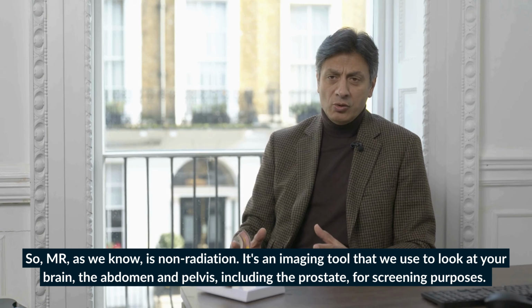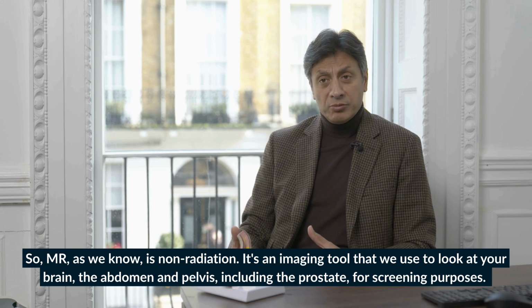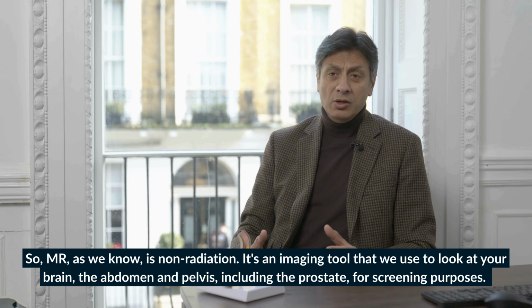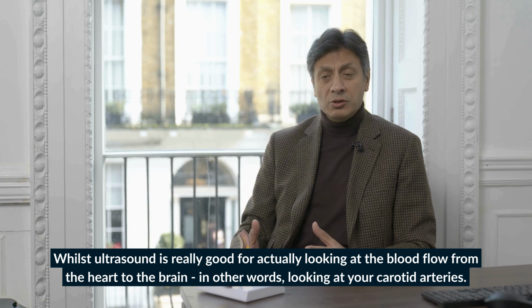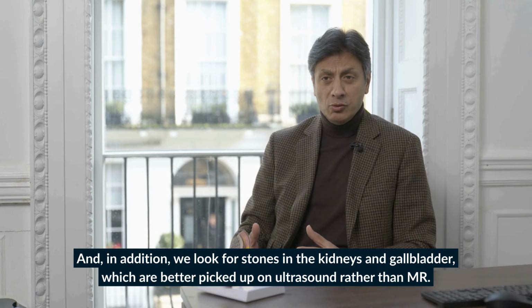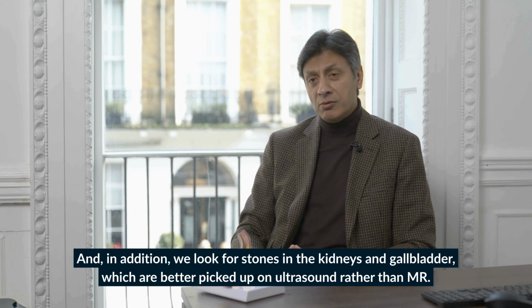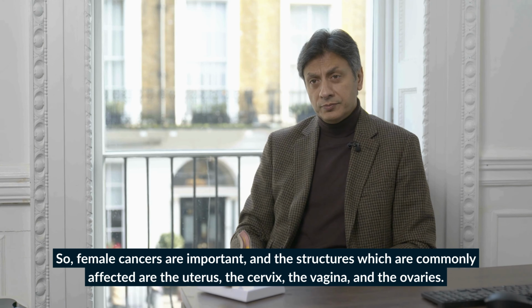So MR, as we know, is a non-radiation imaging tool that we have to look at your brain, the abdomen and pelvis, including prostate for screening purposes. Whilst ultrasound is really good to actually look for the blood flow from the heart to the brain, in other words, looking at your carotid arteries. And in addition, we look for stones in the kidneys and gallbladders that are better picked up on ultrasound rather than MR.